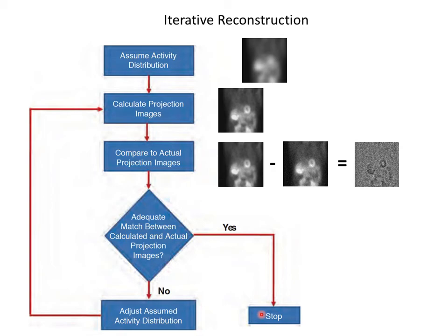So what goes into that is some understanding of the noise that you expect. Because if I had a perfect cartoon drawing of what all of my activity would be with no noise, I'm still going to get a difference between my predicted raw data and the actual raw data, because the actual raw data has uncertainty and noise on it.